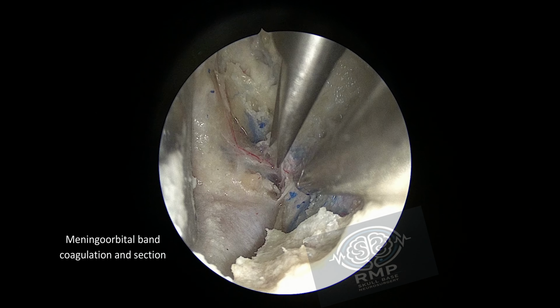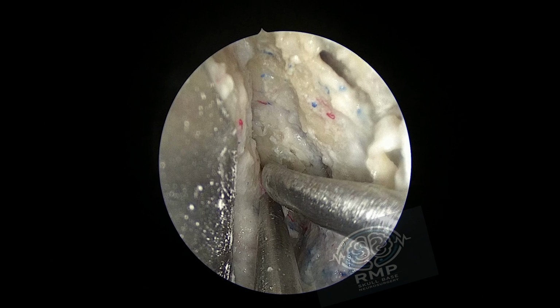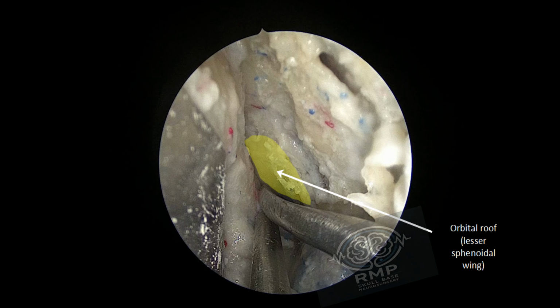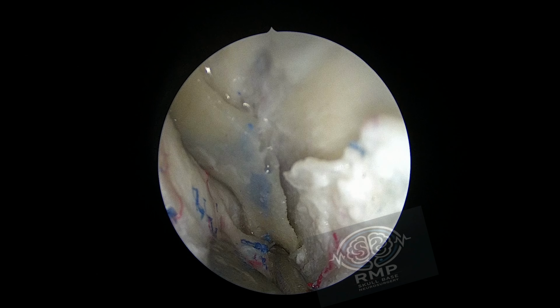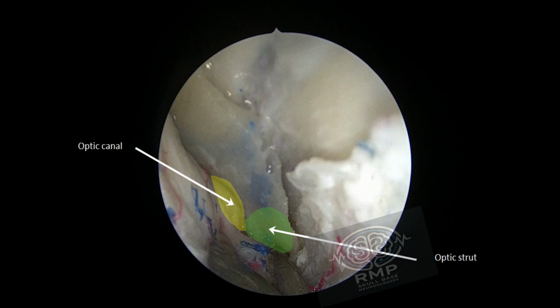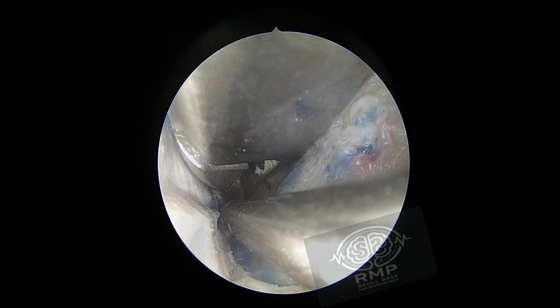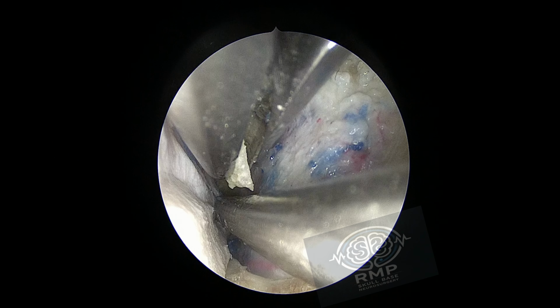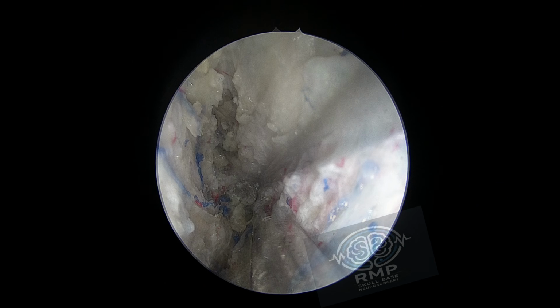Here we are separating the dura propria and the meningeal layer using sharp techniques. Then the endoscope is advanced in the inferior margin and superiorly allows us to identify the roof of the orbit and, more distally, the anterior clinoid process and optic canal. In this case, we are going to perform an anteroclinoidectomy using the non-drilling technique. So here we are just backbiting the roof of the optic canal.